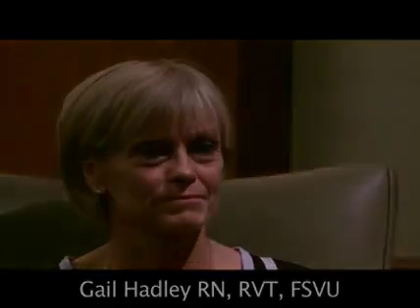I'm Gail Hadley. I'm the Technical Director of the Vascular Ultrasound Core Lab at Mass General Hospital. This presentation will discuss the details on how to conduct a renal artery duplex scan.